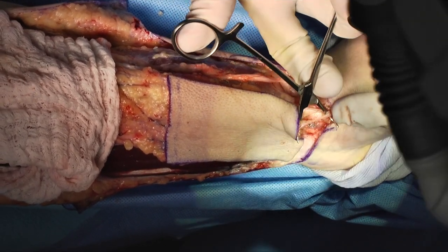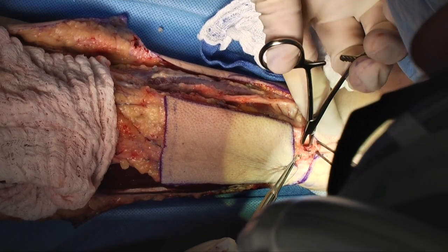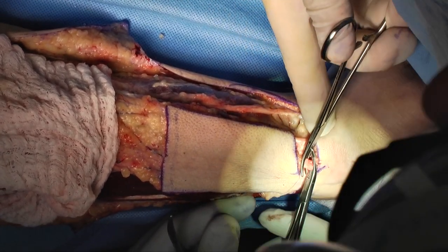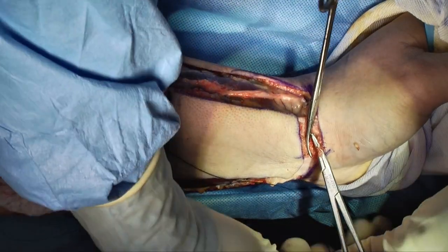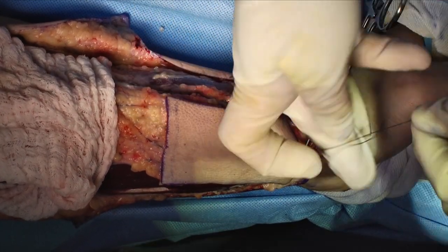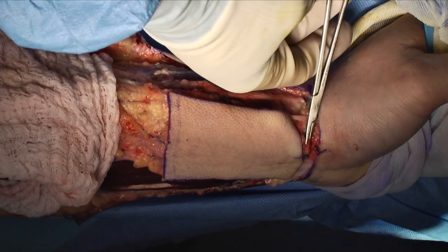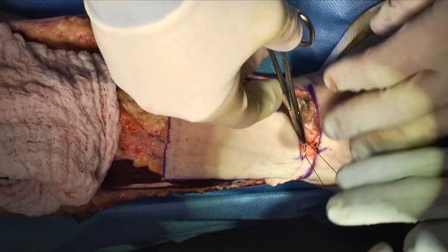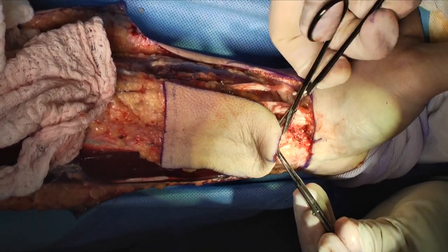After dissection of the ulnar aspect of the skin paddle, we begin searching for our radial artery. Generally a mosquito forceps is used for this. Smaller veins around the artery are bipolar cauterized or sometimes even tied, and the radial artery is clamped on both sides and physically tied with silk ties. The radial artery generally lies in this location and can sometimes be partially obstructed by the flexor retinaculum.